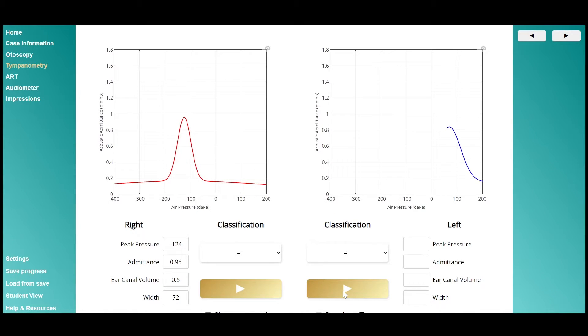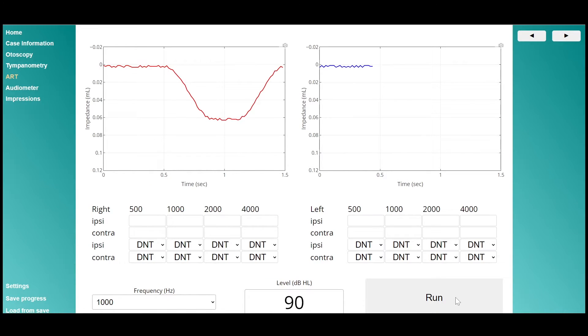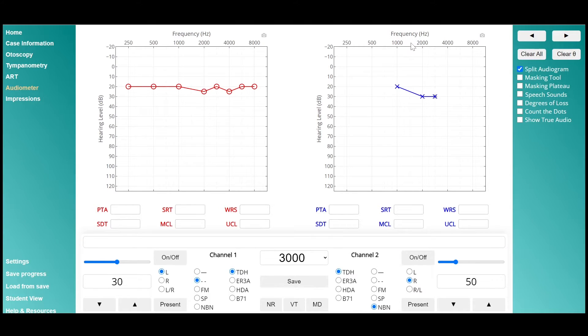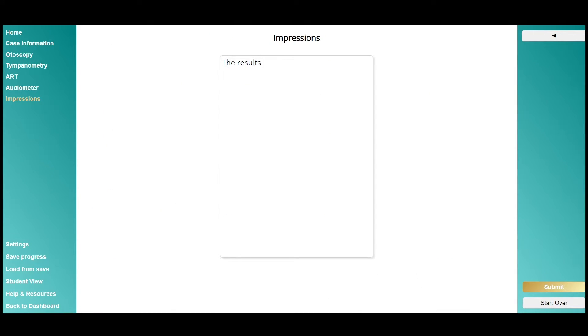complete tympanometry, even do acoustic reflex threshold testing, in addition to audiogram creation, and adding a space to type up reports and impressions.